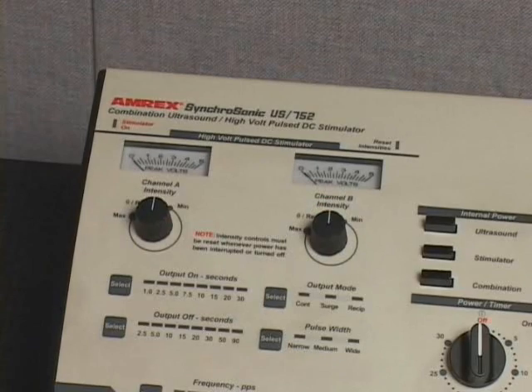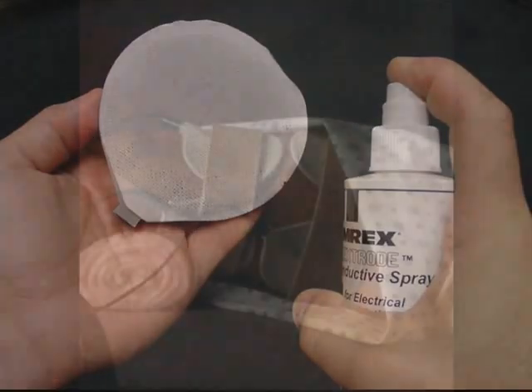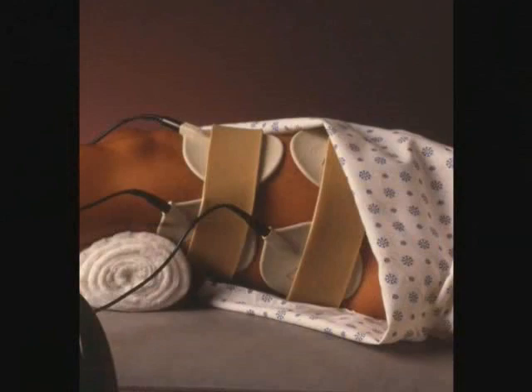The U.S. 752 is equipped with an intensity reset circuit feature. This feature prevents the practitioner from applying one patient's intensity setting to another patient. Prepare the pad electrodes and apply them to the patient. The pad electrodes may be held in place by means of retention straps or weight bags.